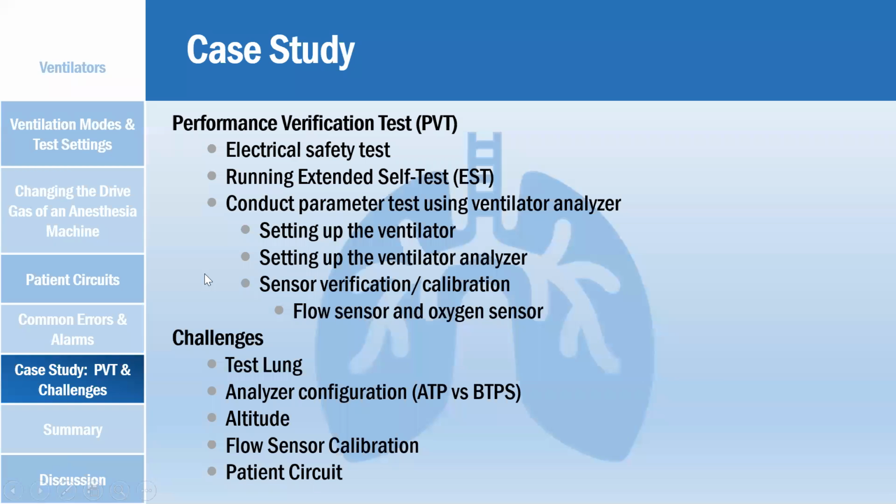The challenges that they have are the test lung. Some of the test lungs are too old, so they end up not giving proper pressure, and they are very sticky. And analyzer configuration. When you talk about analyzer configuration, it is on the ventilator analyzer. You always have to look into the ATP and BTPS settings. At the same time, the driving gas plays a very important role.